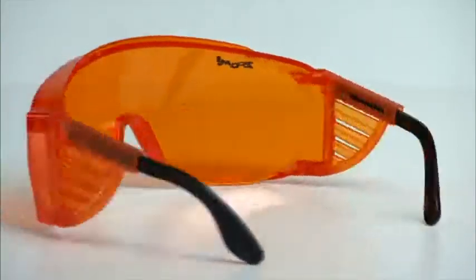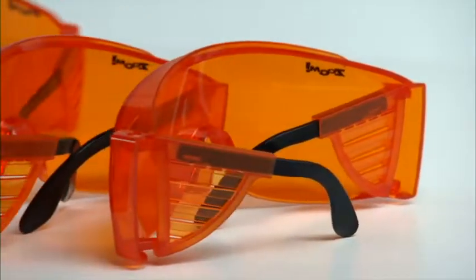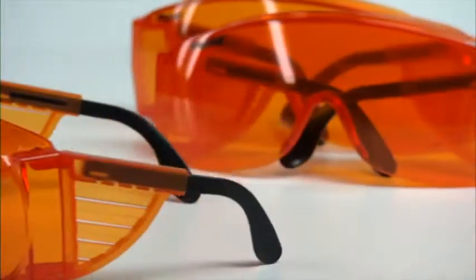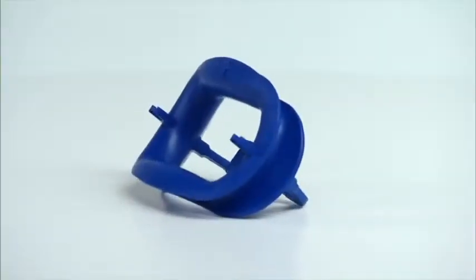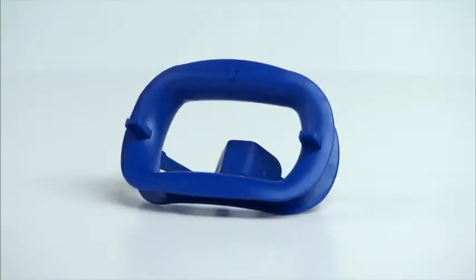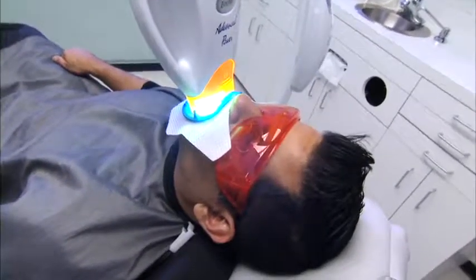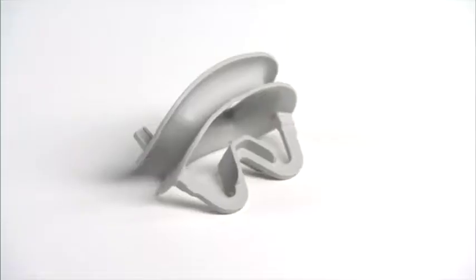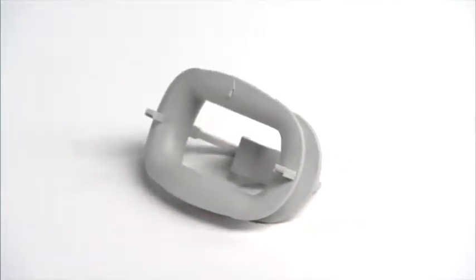Make sure each participant wears Zoom protective eyewear. If you need more, contact your Discus representative. Do not substitute with eyewear supplied for use with lasers or other dental lights. The ISO prep retractor provided is necessary to ensure proper positioning of the lamp head and additional protection from the light. The ISO prep is a universal size and will fit the majority of patients. Small retractors can be purchased separately and kept on hand for special cases.